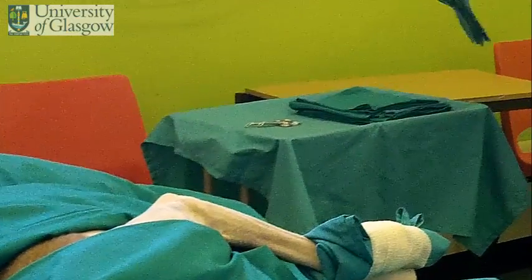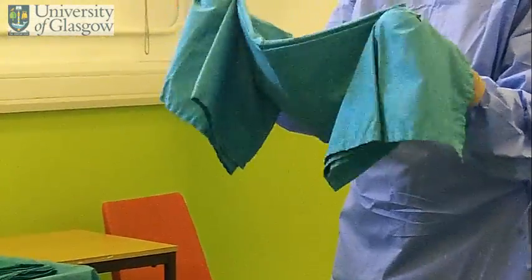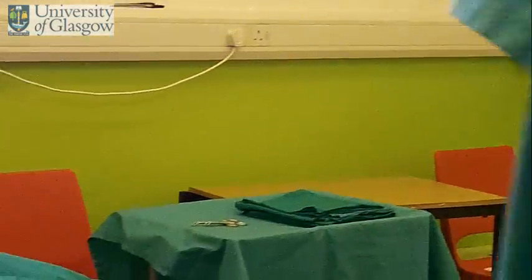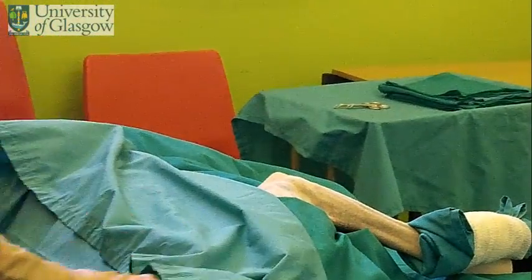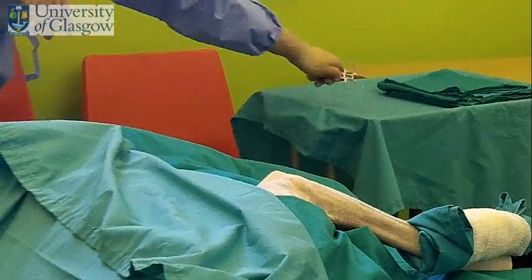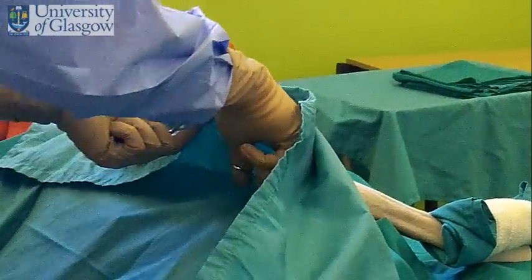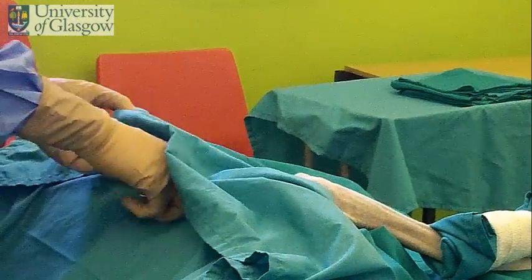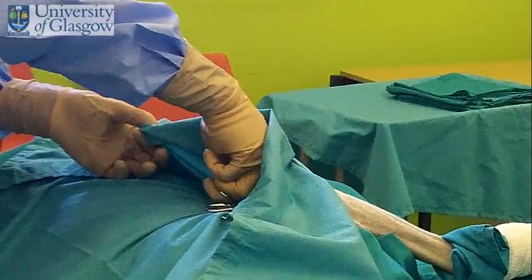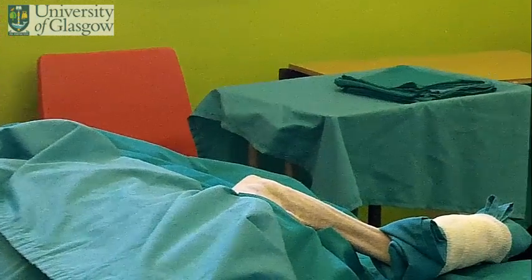Now your final drape is going to be placed. Hold the drape on itself. You're going to walk around the table carefully.